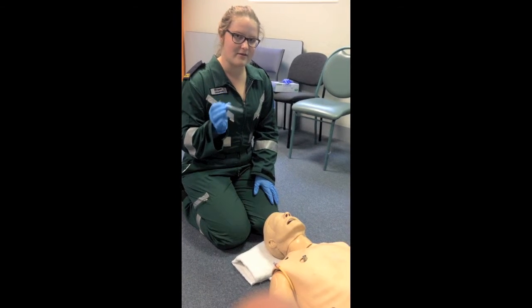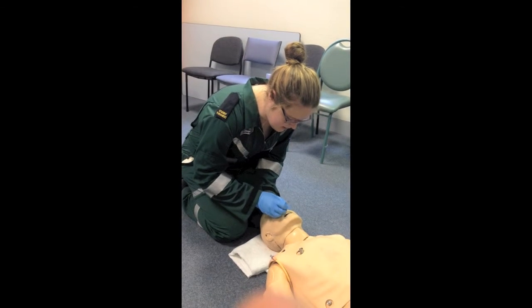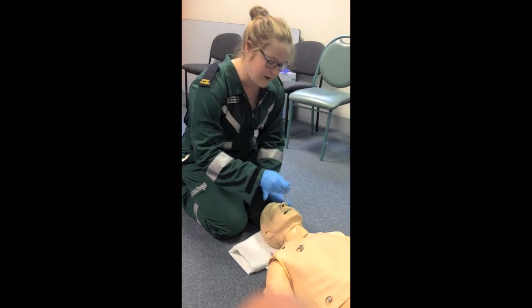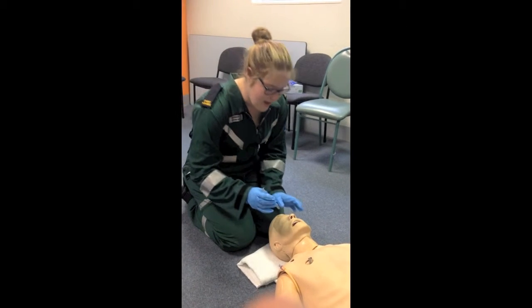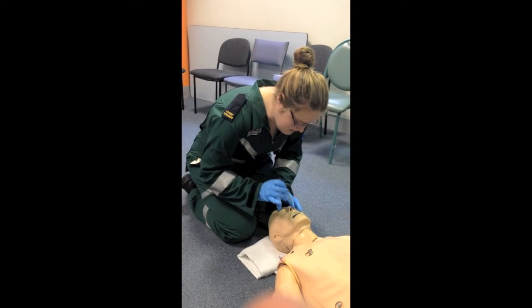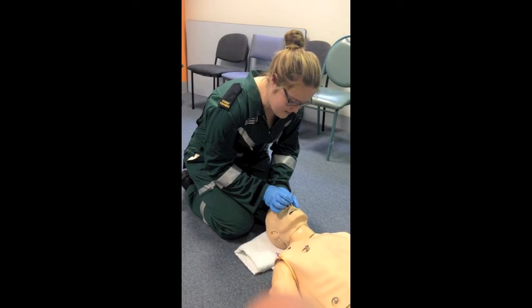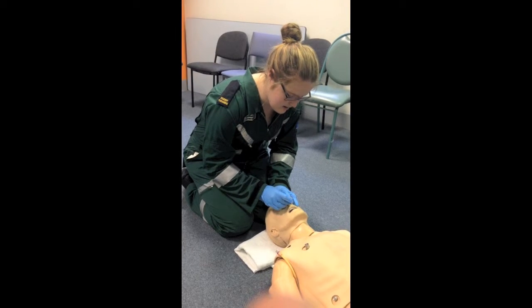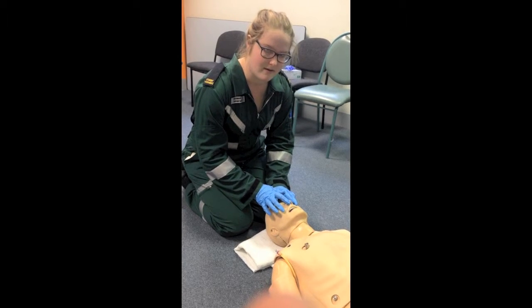A common error in insertion of the nasopharyngeal airway is just sticking it right into the nostril without twisting it as you go. That can cause damage to the nasal passage. The correct way to do it is to lubricate the ends with KY gel, and you find the biggest nostril and tilt the nose up towards the eyes. So biggest nostril, and then you slowly rotate it clockwise and anti-clockwise as you insert it gently. And again, you have to check that you have a correct seal.